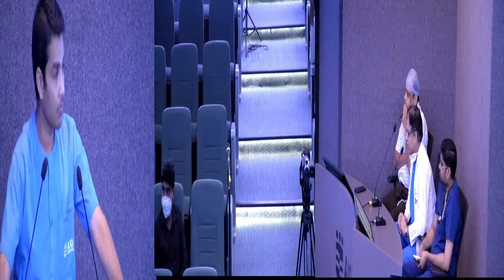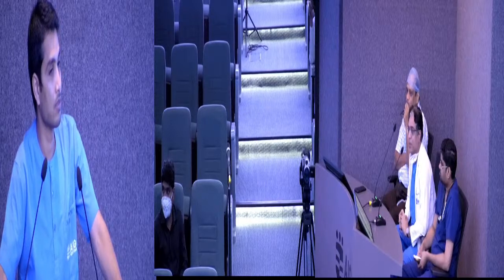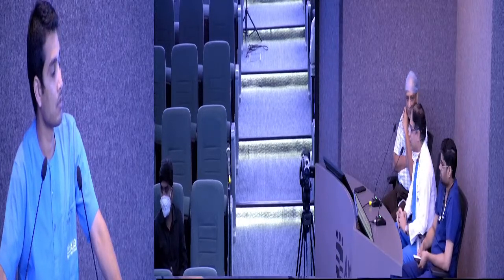Basically, it's not a substitute for CABG, but predominantly these are patients who are surgically declined because of comorbidities, and you have to achieve a near complete revascularization by minimizing the risk. Ever since Impella has come, there is a lot of talk about IABP being not so useful, IABP being useless, but we shouldn't forget where we practice, and we practice in India, and IABP still has a role.